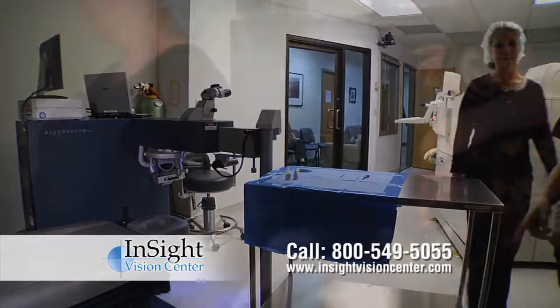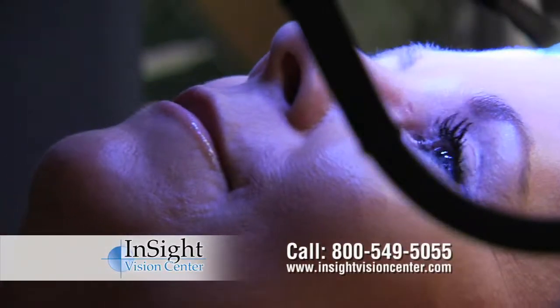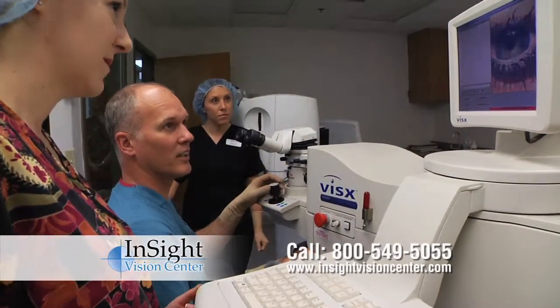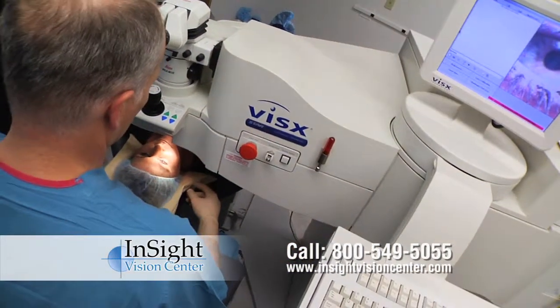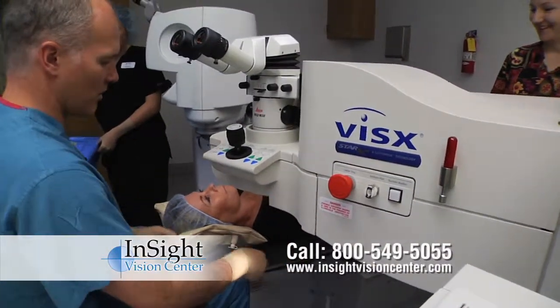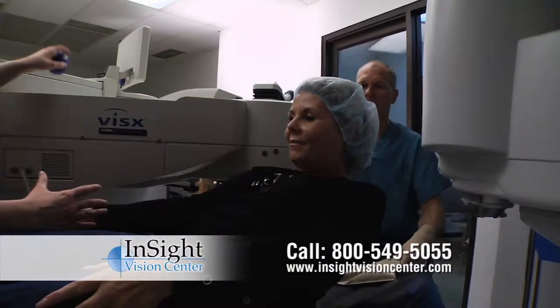What usually happens on your LASIK day, you arrive at the office and check in, and we give you a Valium to make sure you're relaxed and comfortable during the process. We then move you over to the laser center where we administer eye drops to anesthetize the eye, numbing drops. The procedure itself is not painful because of the eye drops. The actual laser treatment itself will take 15 to 20 minutes. It's not painful, and afterwards your eyes usually feel pretty comfortable. Most people following the procedure go home, take it easy, take a nap, and have very little if any discomfort.